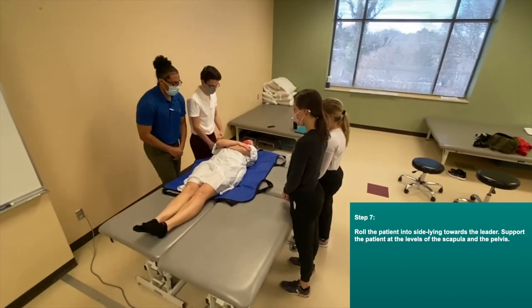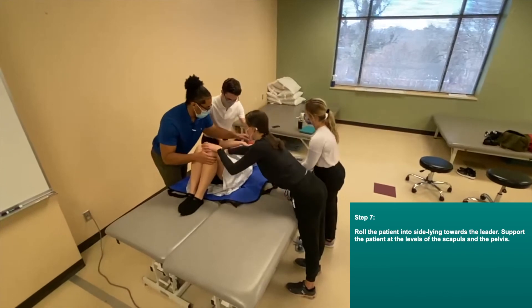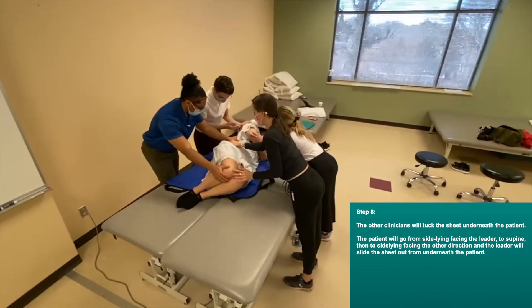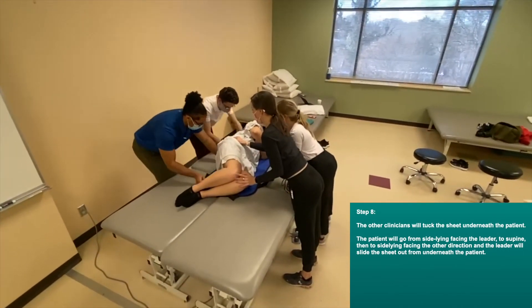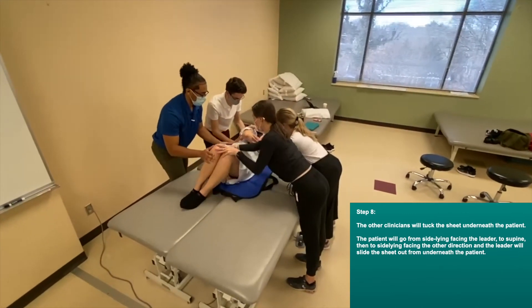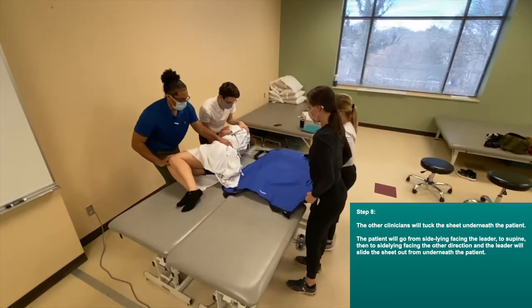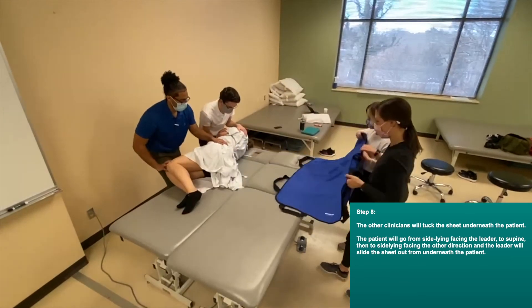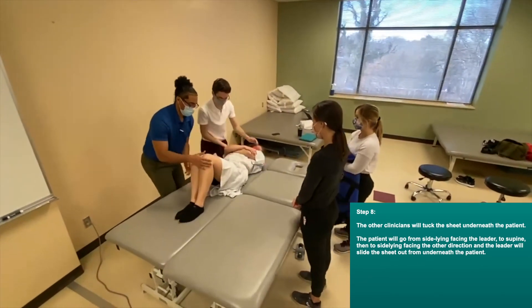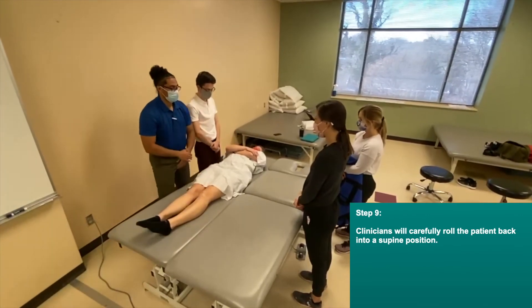Roll the patient into side lying towards the leader, supporting the patient at the levels of the scapula and the pelvis. The other clinicians will tuck the sheet underneath the patient. The patient will go from side lying facing the leader to supine, then back to side lying facing the other direction. The leader will then slide out the sheet from underneath the patient. Clinicians will carefully roll the patient back into supine position.